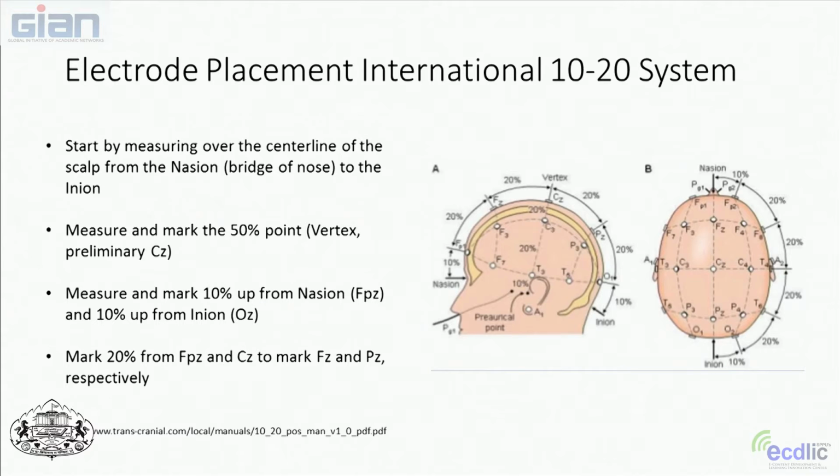Okay, so how would you place these electrodes on the head? We actually have a study right now where we have a bunch of techs that come and do this. Depending on how many electrodes you're placing, this can take from minutes to hours. So sometimes it gets very hard for the patients to sit that long.